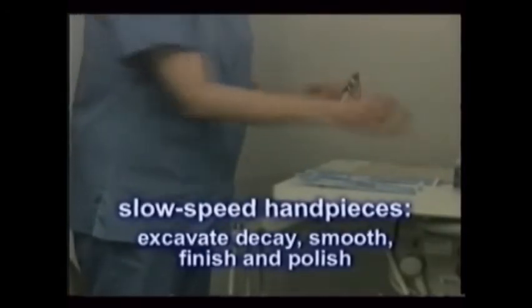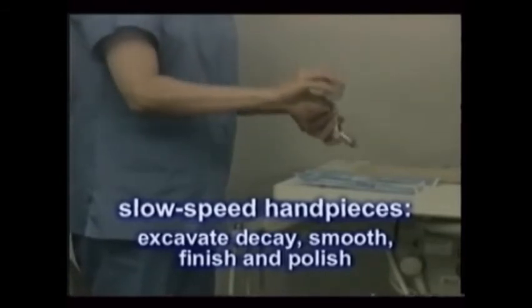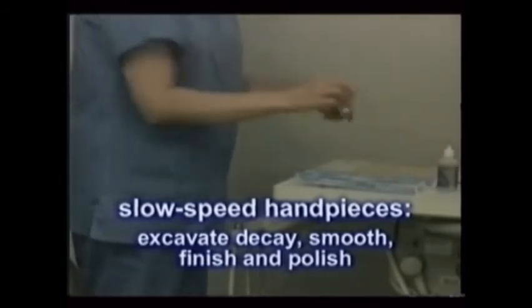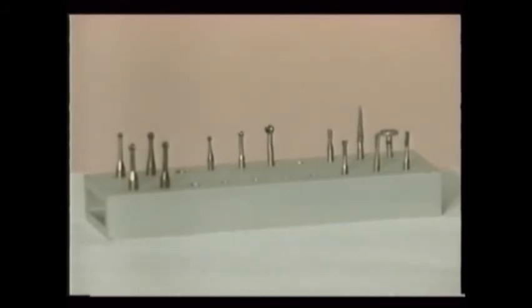Slow-speed handpieces are used to excavate decay, to smooth, finish, and polish restorations, and to polish teeth. They also have unique inserts that are used during root canals and various other procedures. The different dental burrs, which resemble very small drill bits, help create the desired shape of the space into which the restoration will be placed. All dentists are unique and particular about the burrs they prefer to use. It's a reflection of their training.